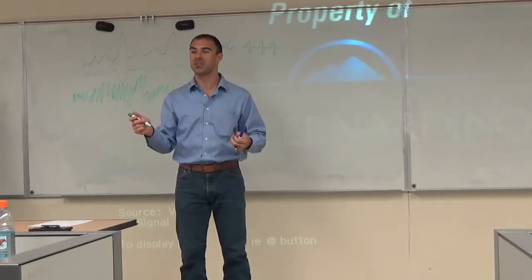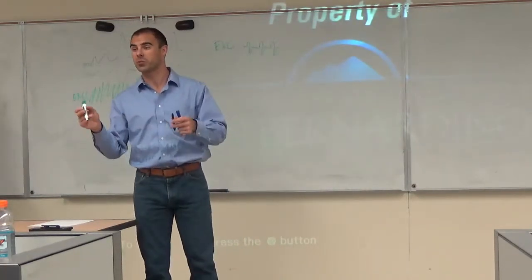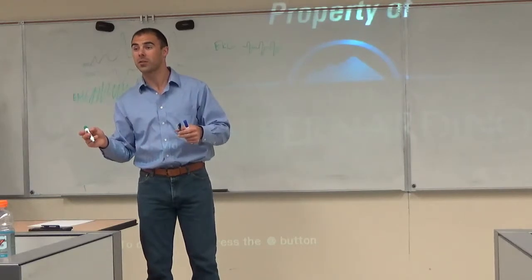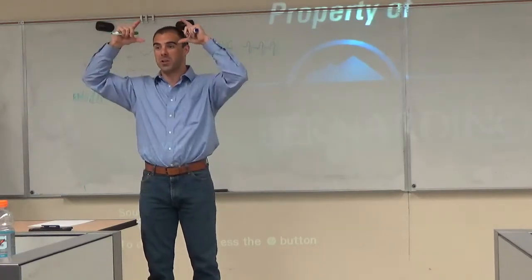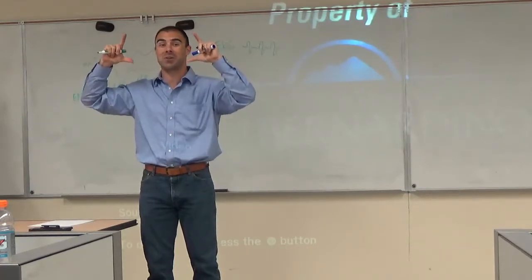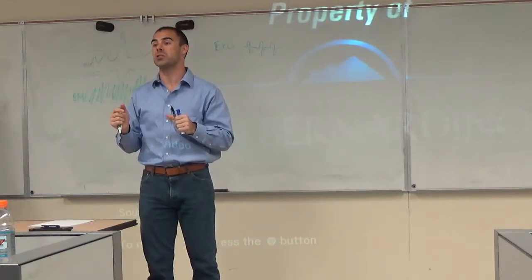I don't remember, but I know it gives the eyes, where your eyes go. If your head moves that way, your eyes go that way. Yeah, so instead of the blinks, which are not actually the eyes, it's actually muscles of the eyelids. HEOG is actually movement of the eyes horizontally.